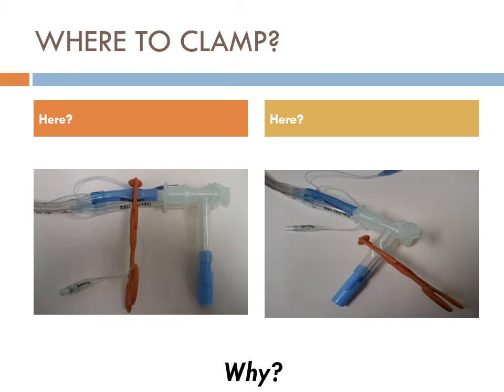Are you guys getting this, or is this good to talk about? I'm ventilating through the tracheal port here. I'm ventilating both lungs. The other option you could do, if you don't have a clamp, and well, actually no, that's the only option you can do.